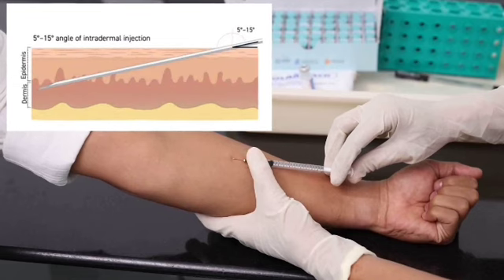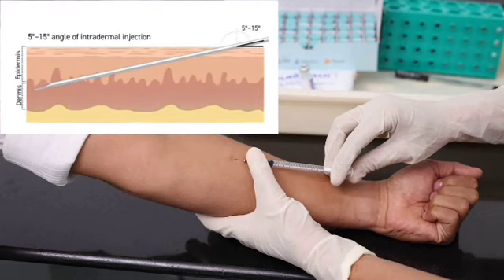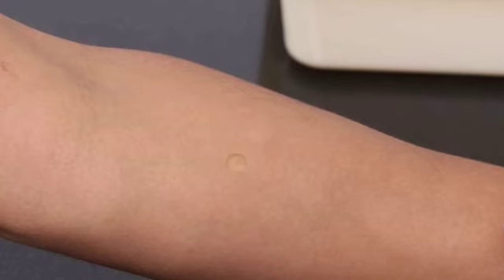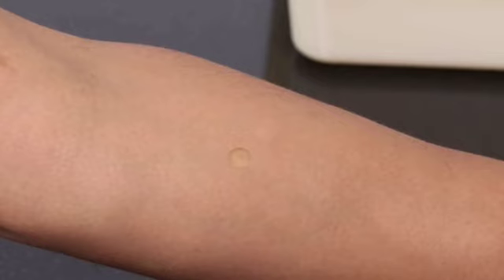Avoid areas of skin with veins, rashes or excess hair. Inject the test solution into the superficial layers of the skin on the volar surface of forearm. A 6 to 10 mm wheal or papule is formed. It is a pale, raised area with distinct edges, having orange peel appearance that does not disappear immediately.